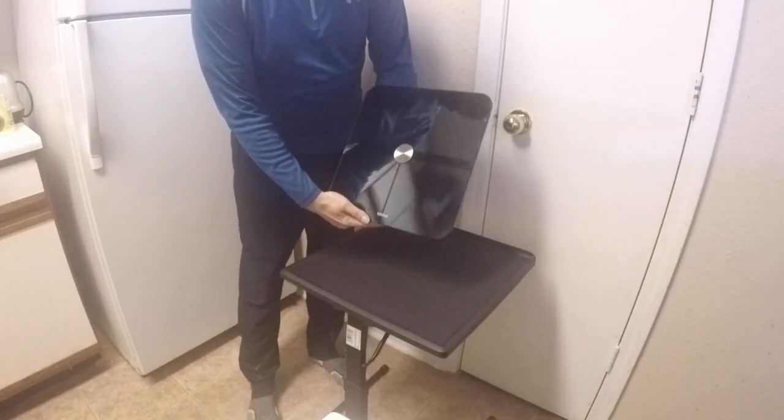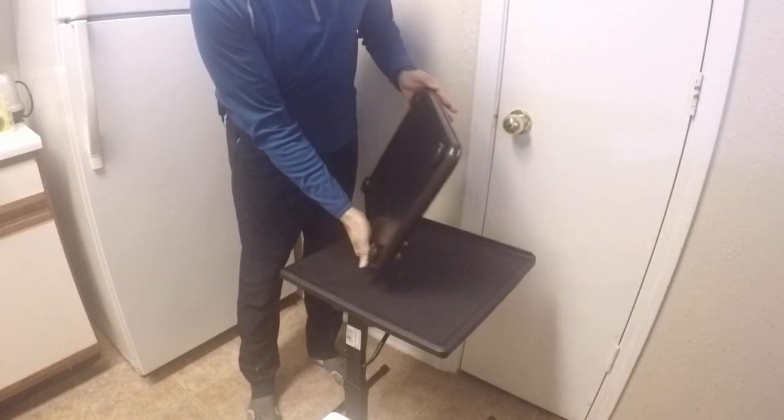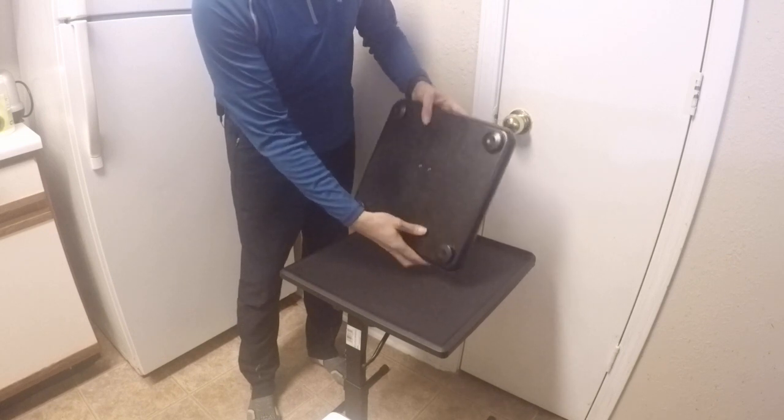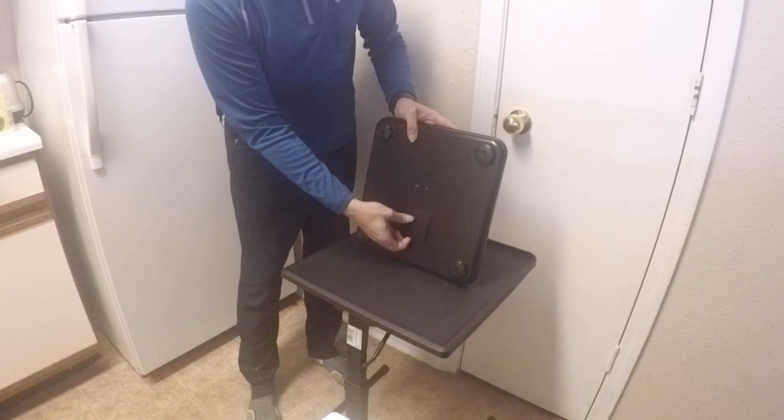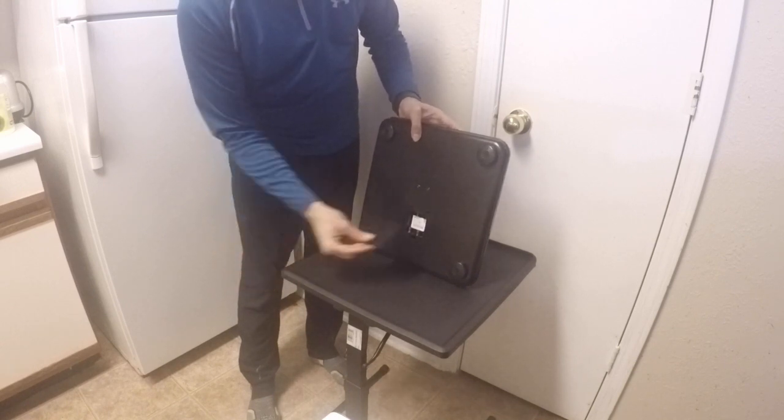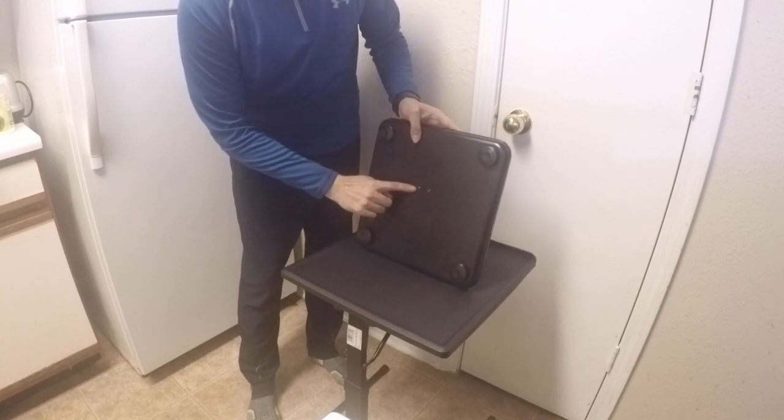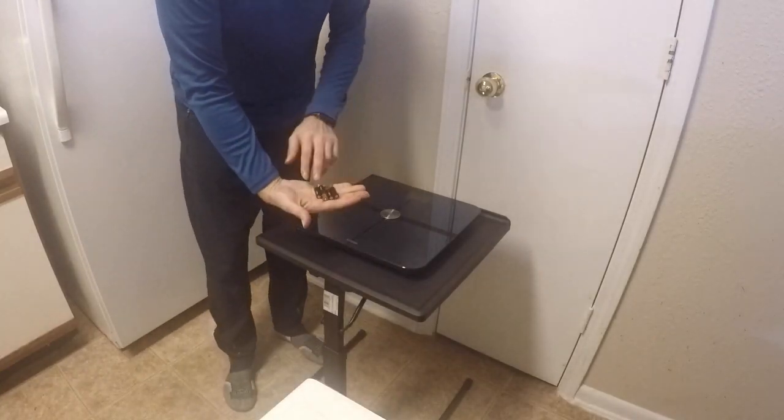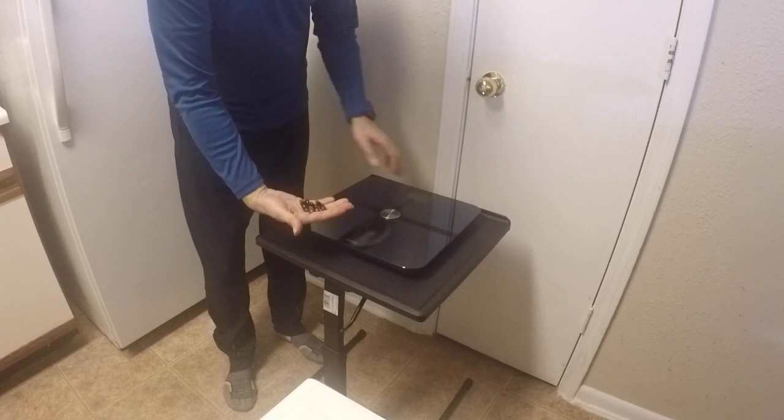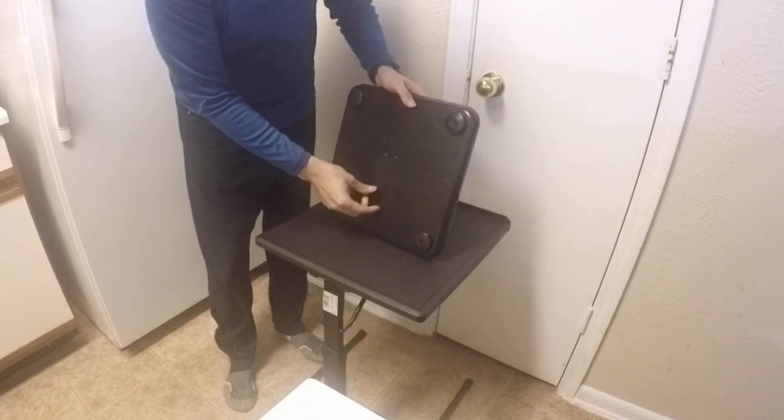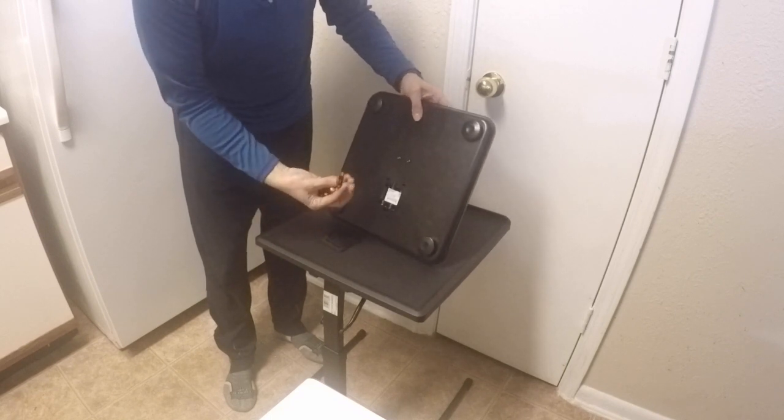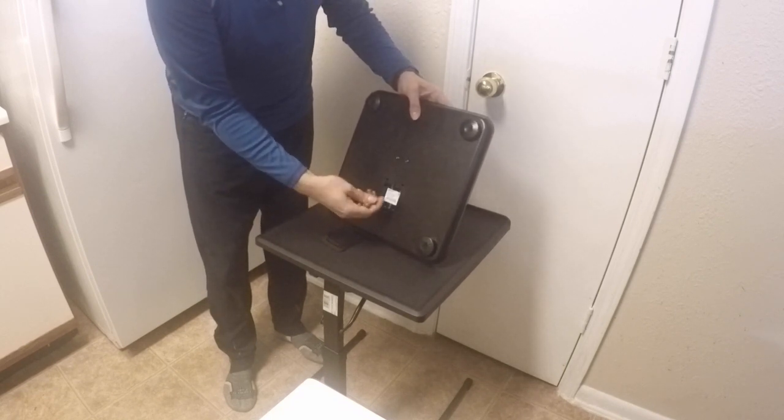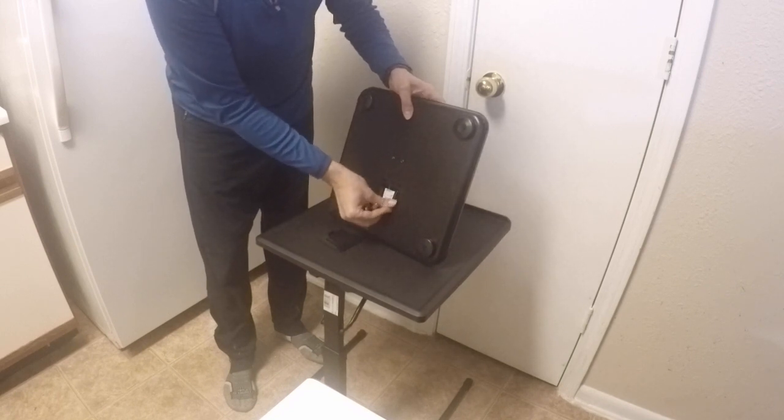The back of the scale is where you have the compartment for the batteries. Right now it's empty because I haven't used it for a while. And then you have the buttons to link and to lock it. I have the four batteries here—four AAA batteries. So I open up the compartment here and start putting the four batteries.